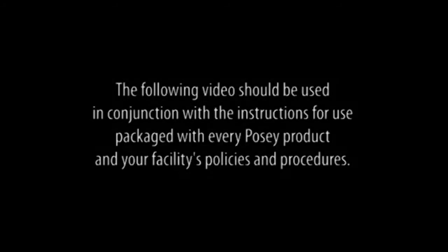The following video should be used in conjunction with the instructions for use packaged with every Posey product and your facility's policies and procedures.